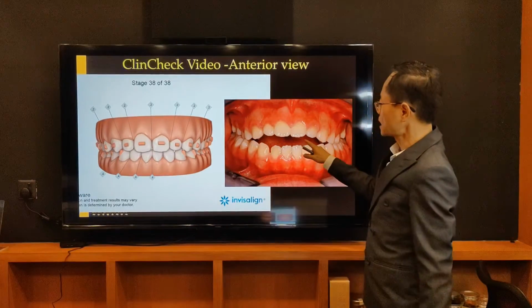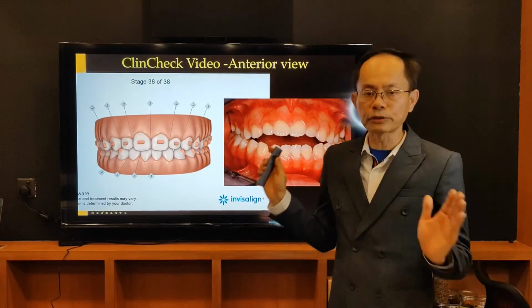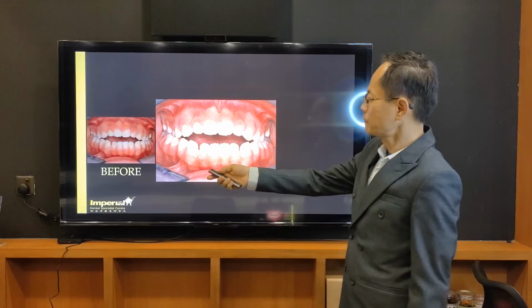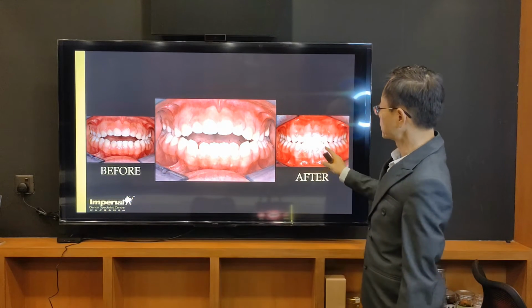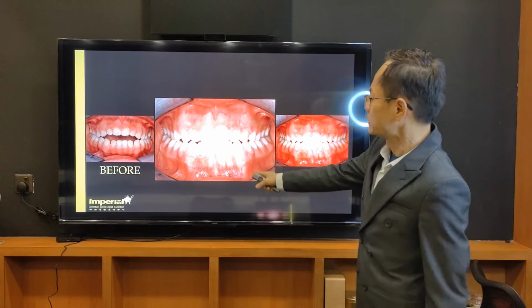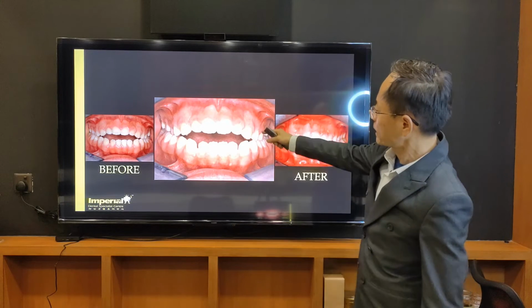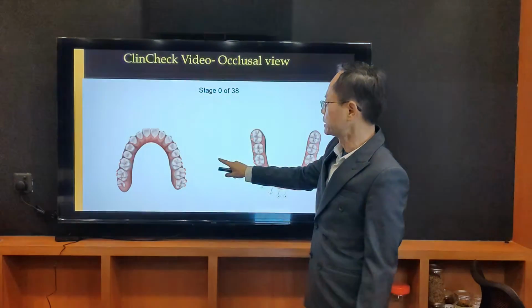As you can see, the tongue is very big and in between here. So this is what we predicted with the treatment plan, and this is the outcome. The outcome of this treatment is before and after. You can see that we brought it down, and what we predicted is actually what we see here. This shows that the teeth are closing together, by the photo progressive morphing here.